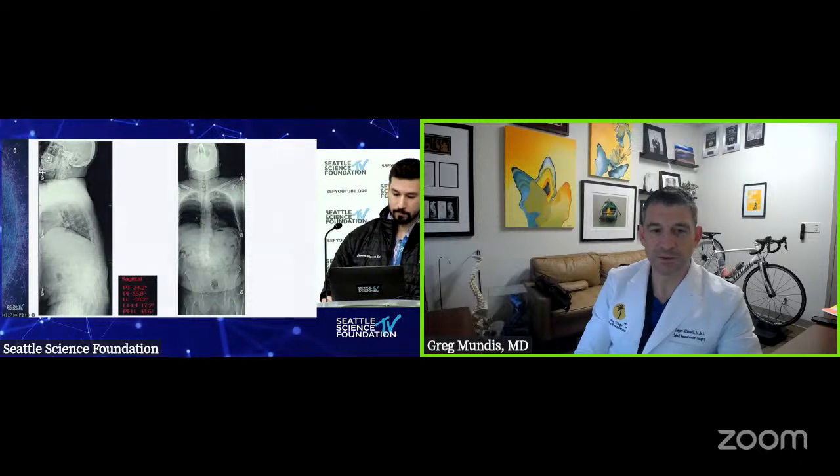So this is a patient where we would probably pretty meticulously look at the Hounsfield units, even though the data suggesting whether or not that's helpful is still out there, but I do think it's at least a surrogate that we can measure. I would probably look at the Hounsfield units at the lower thoracic versus the upper thoracic. I think he needs a relatively significant realignment procedure. And I bet if I'm looking at this right, he's probably going to end up being an upper thoracic case for me.